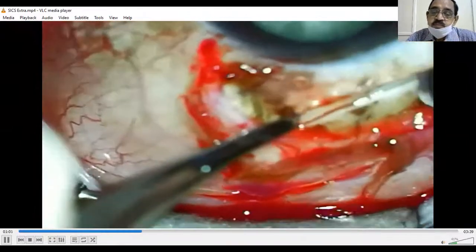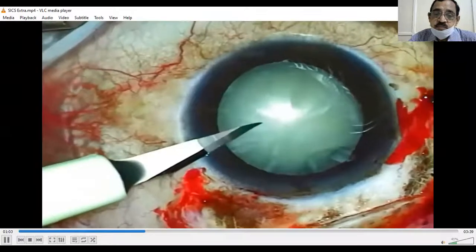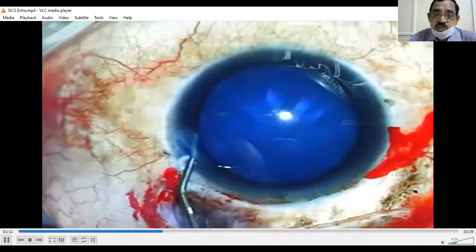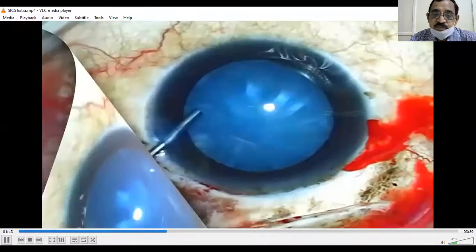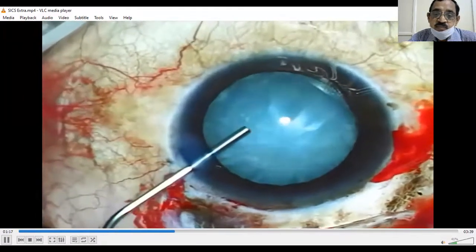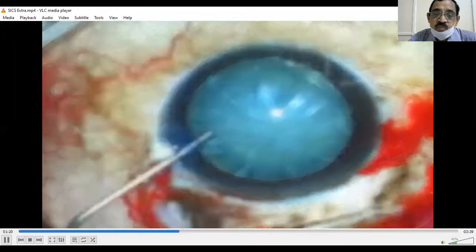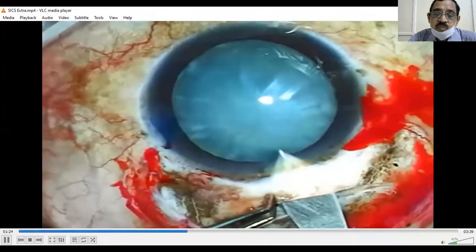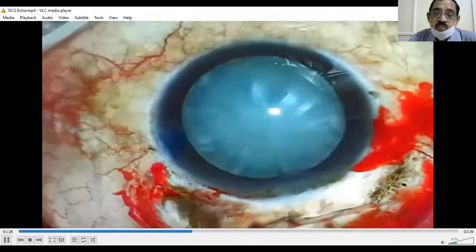Next, a paracentesis port is created, which is large enough to accommodate the Simcoe cannula. Vision Blue is injected into the anterior chamber to stain the lens capsule, and then is rinsed with balanced salt solution. The anterior chamber is then filled with viscoelastic. The keratome blade is then used to enter the scleral tunnel that was formed previously and aim downward, similar to how you would make a triplanar incision in clear corneal cataract surgery.